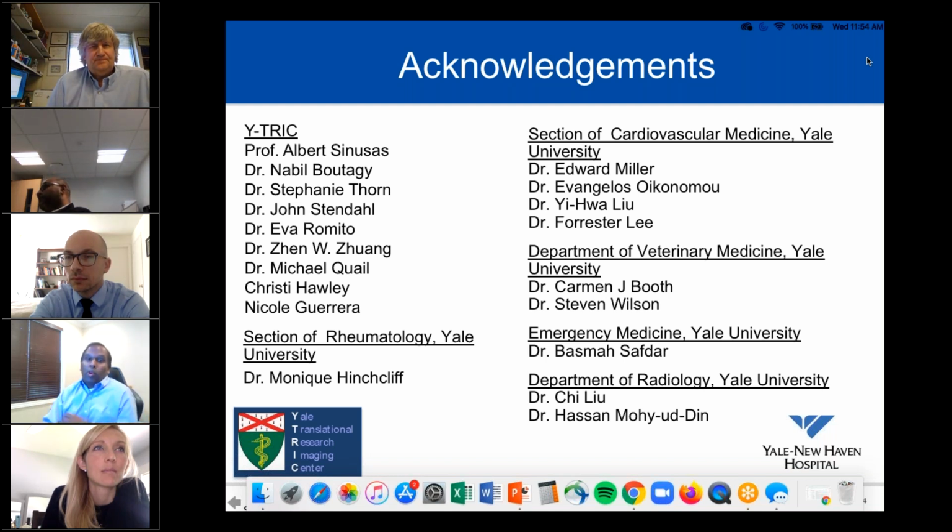And along those lines, for both of you, what change in flow reserve from year to year should prompt further investigation? We know there's some variability in these measurements. The PET is not perfectly precise. There are some errors, and of course, changes in resting hemodynamics come into it as well, and differences among scanners and infusions, doses, all weigh into it. So how much of a flow reserve or a stress flow change from last year to this year for a transplant patient should prompt further investigation or a change in immunosuppressive therapy?